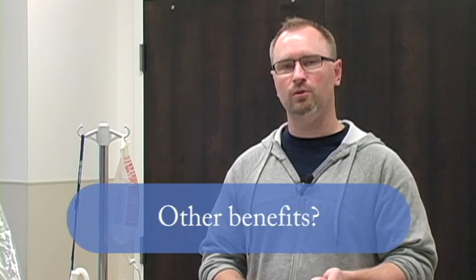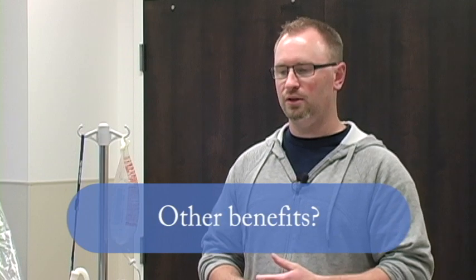The last benefit, and it's a big one for me, is infection control related. Typically our high flow oxygen aerosol delivery systems create an aerosol, as in the name. That's a big enough water particulate to carry infection. So if you have someone of an unknown etiology, pneumonia, or on droplet precautions, and you put them on a high flow oxygen aerosol setup because of their increasing oxygen requirements, then what you end up doing is aerosolizing that infection in the whole room. You pretty much have a 10-foot radius of a cloud of infectious particulate in the air, like walking into a giant sneeze all the time.